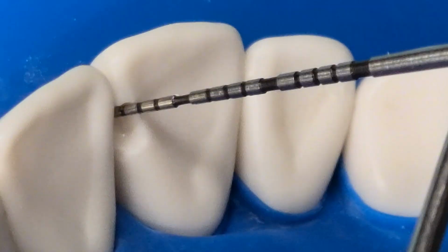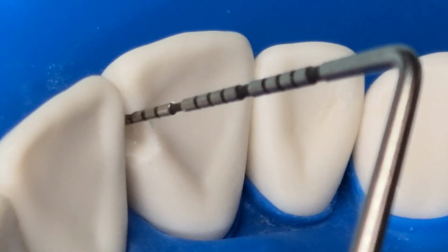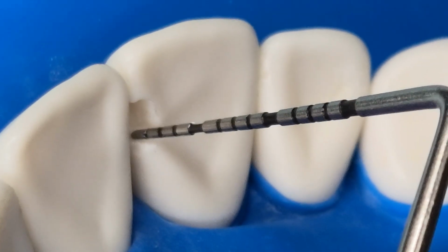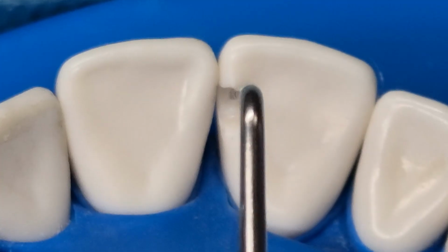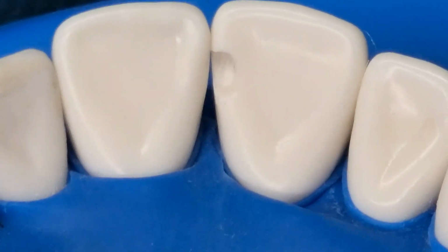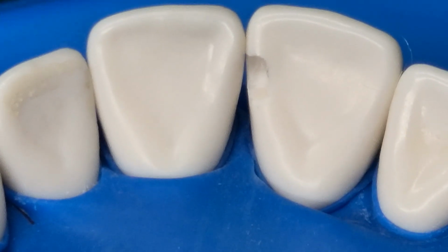Additionally, check the wall orientation. Remember that the walls have to be parallel to each other or slightly convergent, and they should not be divergent. Don't forget to check the smoothness using an explorer.